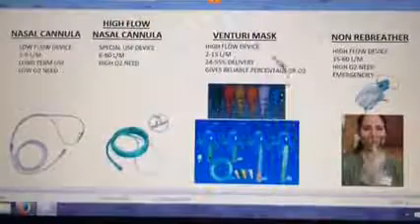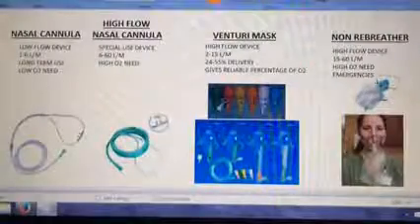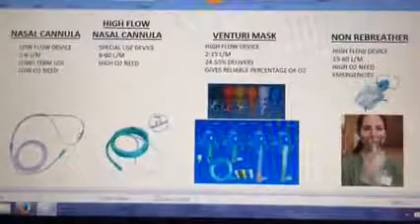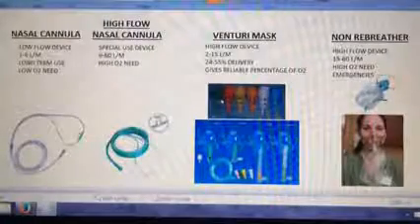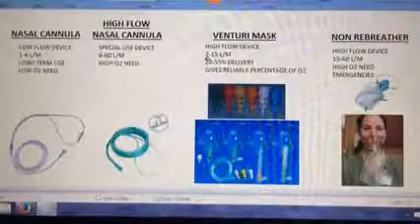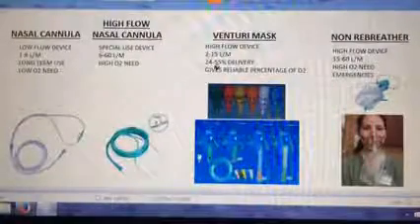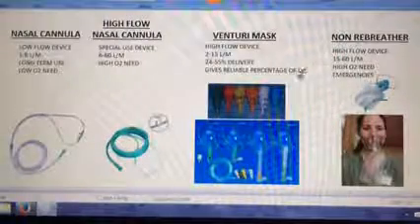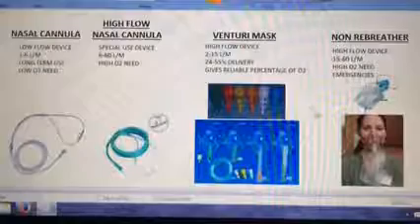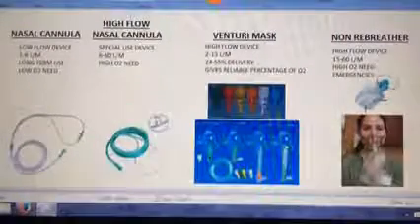The next device is a Venturi mask. This is a high flow device also. The adapters are color-coded and will tell you what percentage of oxygen you'll give your patient and what flow to set it on — usually from two liters a minute to 15 liters per minute. Device delivery is 24 to 55 percent, depending on the brand. It gives a very reliable percentage of oxygen, so if you've already weaned them down from a non-rebreather, you can start at 55 percent on the Venturi mask.